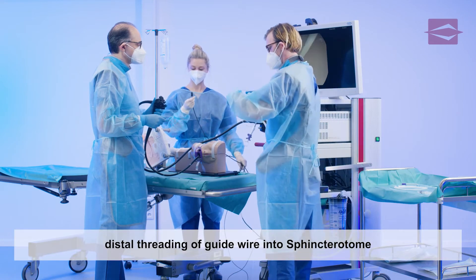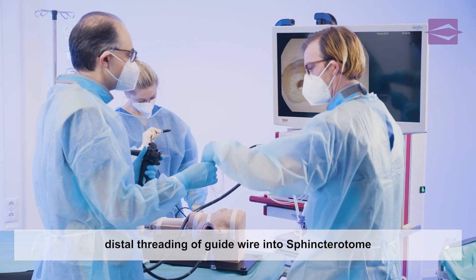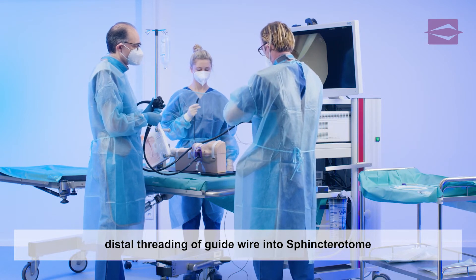The assistant threads the already lying guide wire proximally into the distal sphincterotome tip and pushes it through the guide wire lumen until it emerges proximally from the sphincterotome.